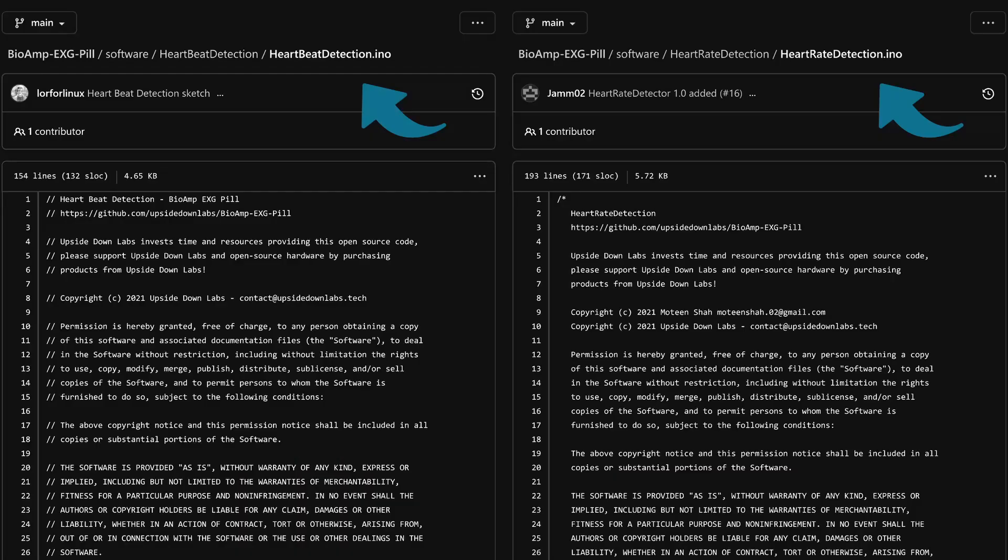A thing that an Arduino can also provide us with, in contrast to boring graphs from ECG machines, is processing the signal. These sketches do just that – they use the magic of math to detect and count the spikes or beats, which can be used in a variety of ways.